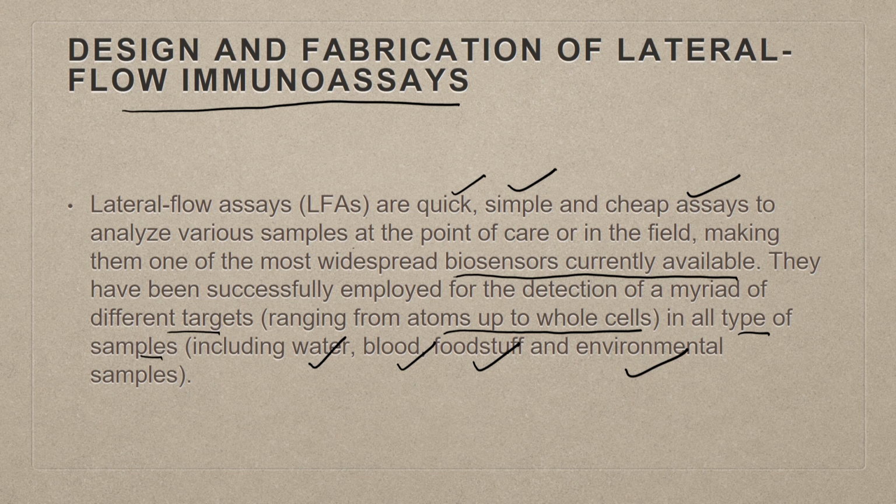These lateral flow immunoassays are being used. So, it is a very potentially effective tool for field application, for transporting them at distance, for using them for our day-to-day detection to extremely tricky and tough detection.